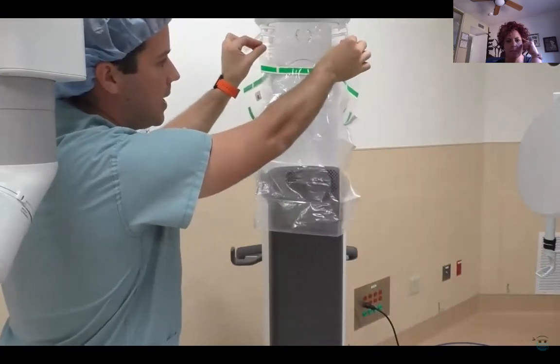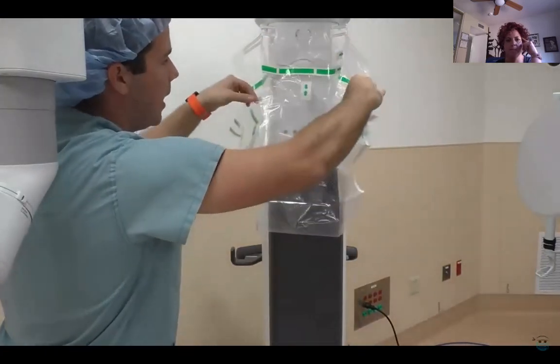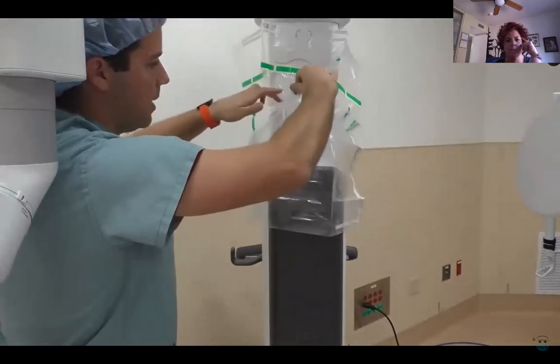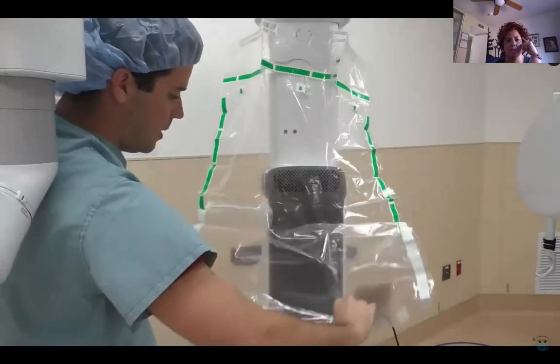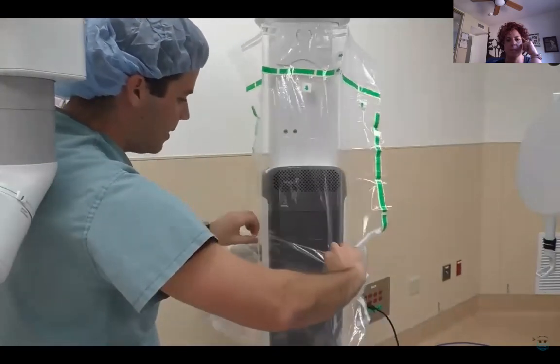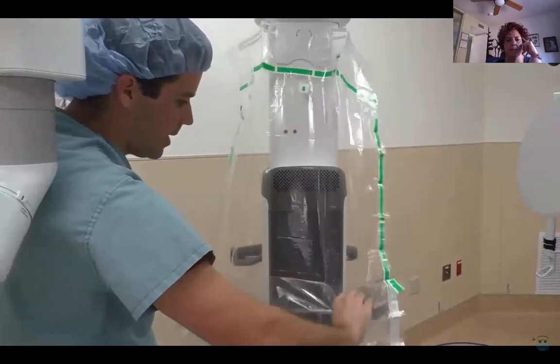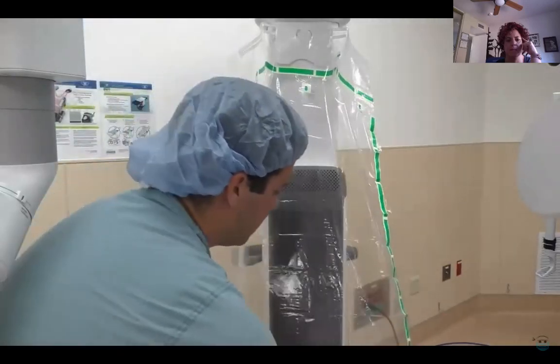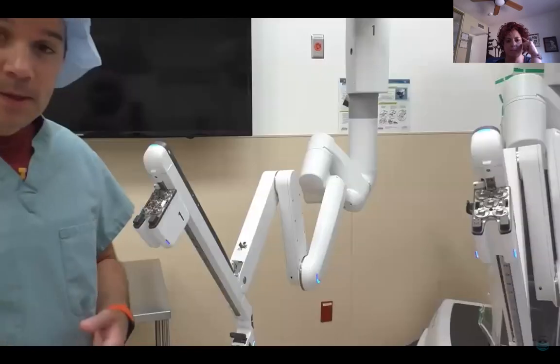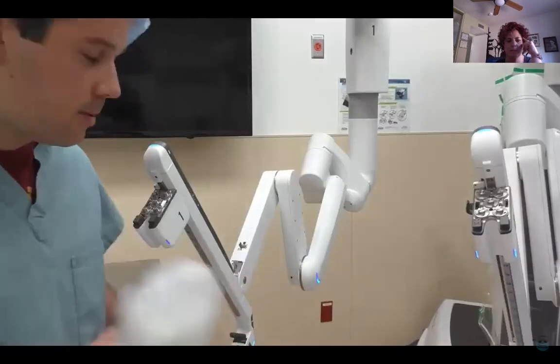I'm holding the outside of the drape, and you're just going to tear the tapes and pull the drape down. Always handling the outside of the drape itself. That's the tower drape. Next is going to be our arm drape.